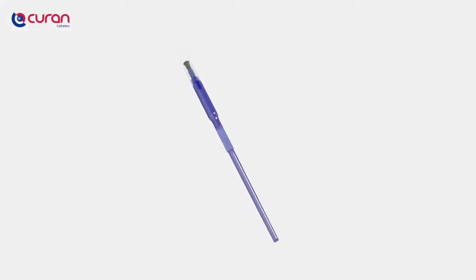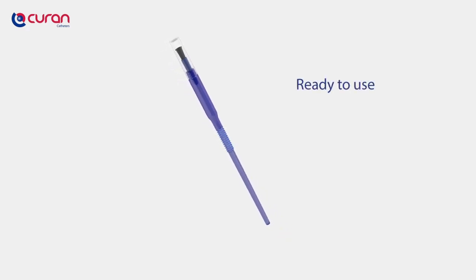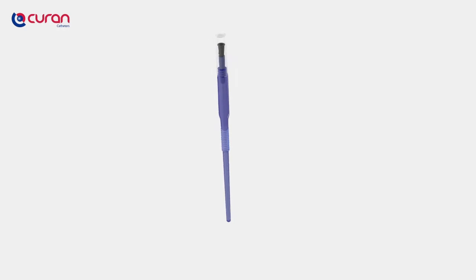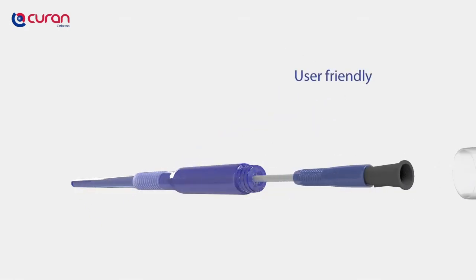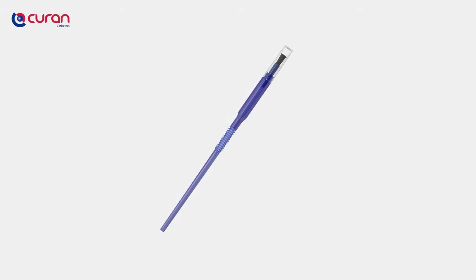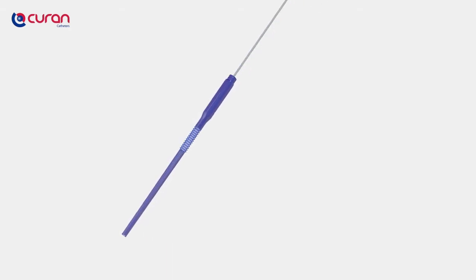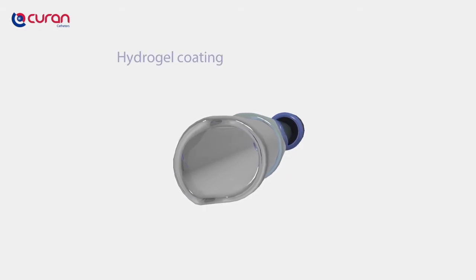The Curan Man is a compact, ready-to-use male device and has an attractive, discreet and comfortable design. It is easy to open, extremely user-friendly and equipped with a Blue Grip insertion device to ensure a hygienic insertion. Each catheter is tested thoroughly and guaranteed safe to use. The Curan Man is coated with a hydrogel coating and guarantees low friction in the urethra upon insertion.